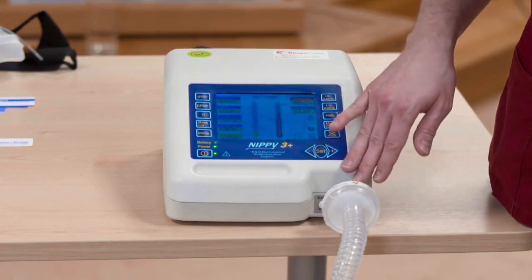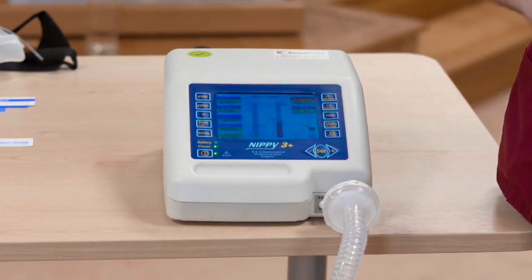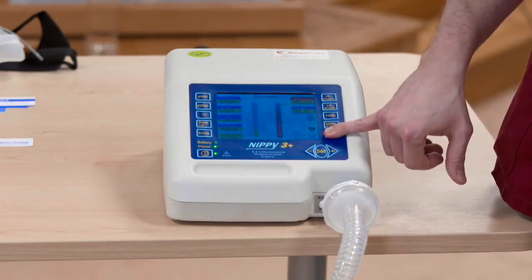This ventilator will give me alarms and warnings to let us know if the patient is not receiving the desired therapy. This style of ventilator will give an alarm noise as so.